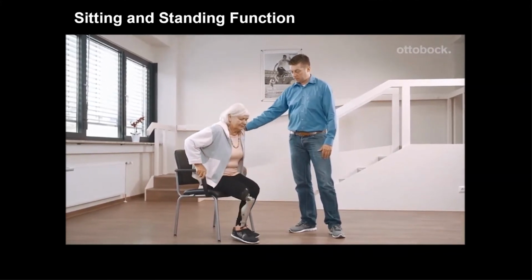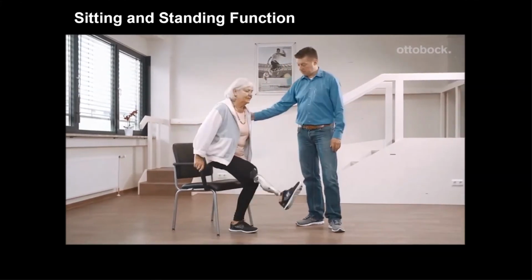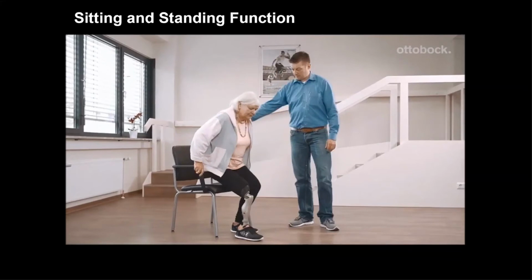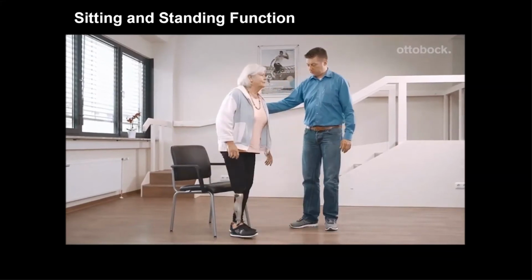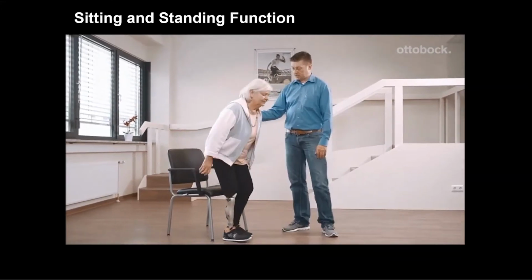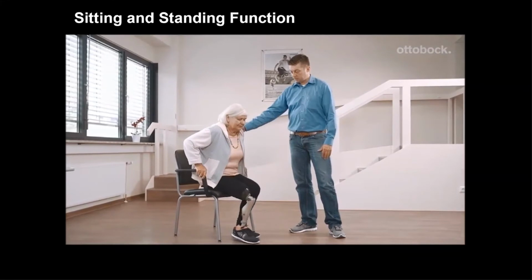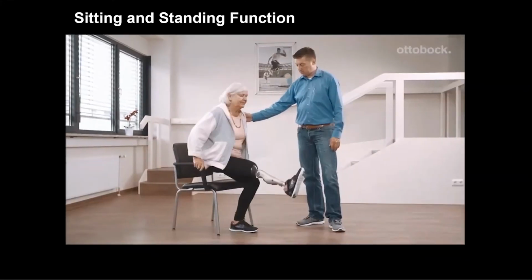And that becomes really important for individuals that are going to go from a mobility device such as a wheelchair and then transition into a walker. So they go into that transition period between pushing off from the wheelchair itself and then lifting their arms off the wheelchair and grabbing onto the walker. And so in that moment of time, they are unstable. The Kenevo provides that momentary stability for them to have that flexion block after they've reached that 45-degree angle. Next slide, Dr. Kannenberg.